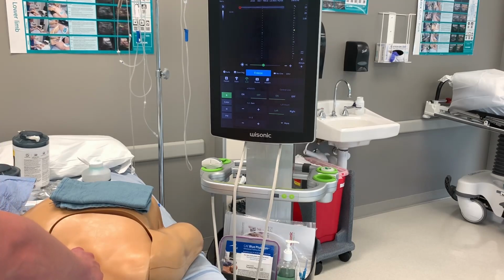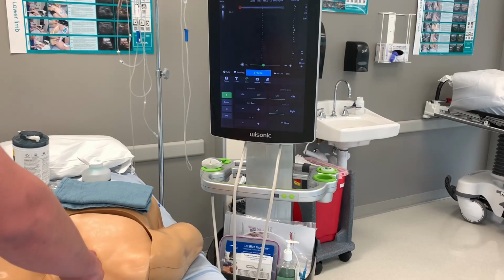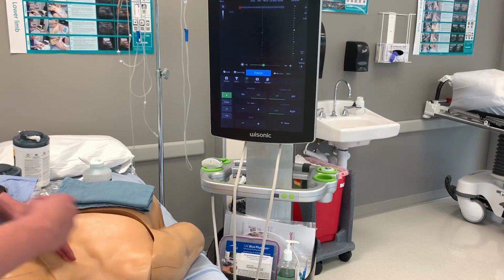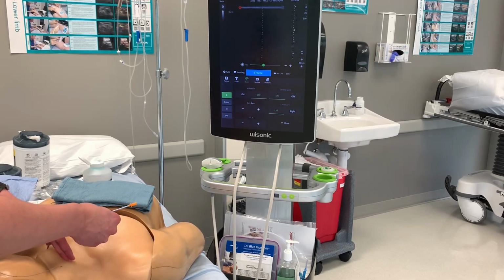So now I'm removing the needle, leaving the guide wire in place, holding pressure to prevent bleeding. Now we're going to put in the dilator. Again, we're just going to thread it down the guide wire. We know the guide wire is located within the target vessel, so we'll just thread it down in it.